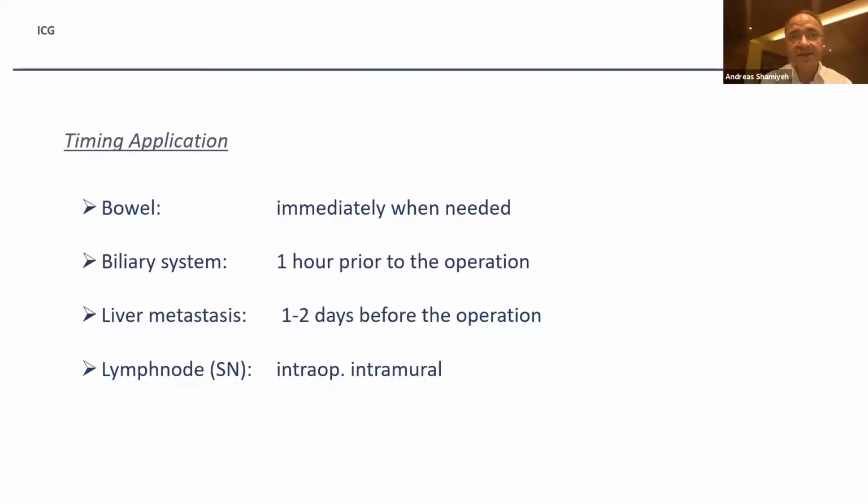And this time depends on the blood pressure. If you have a very low blood pressure, you will see a low fluorescence effect coming very slowly and late. If you have a high blood pressure, then you will see it immediately in good presentation, good color. So this is what we found out. I will show you some pictures now, some slides.